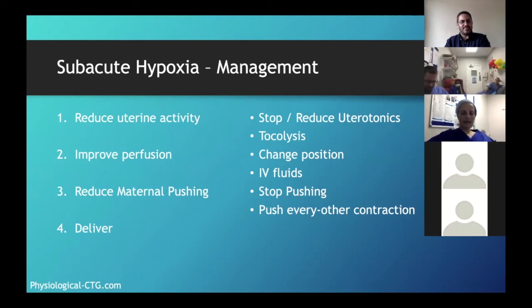Unless, at Kingston, the baby has a scalp clip on his head.